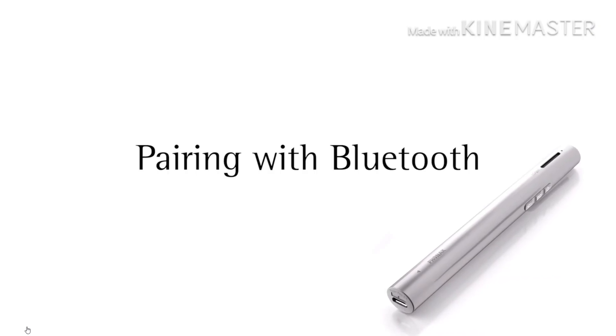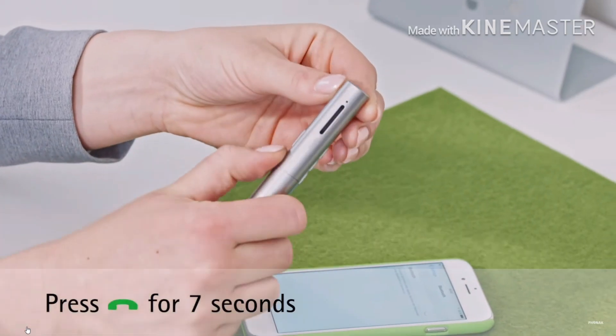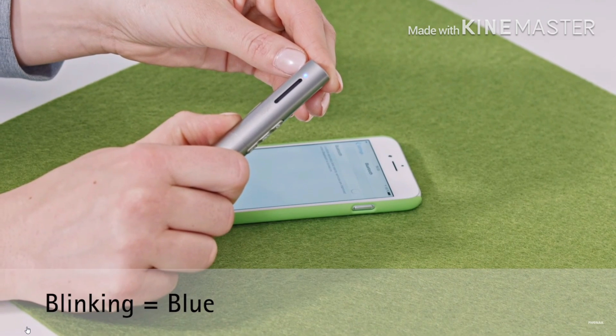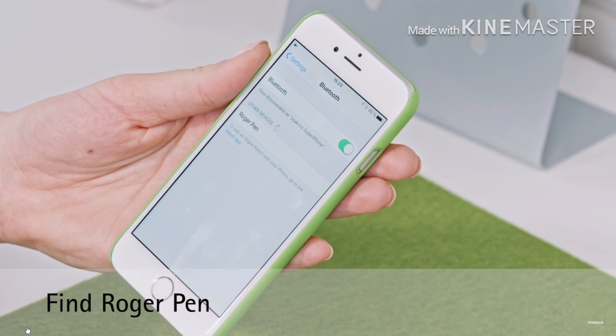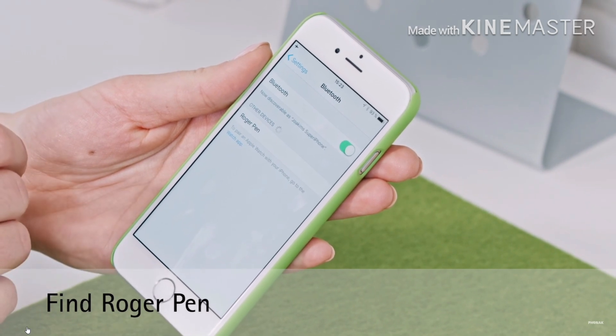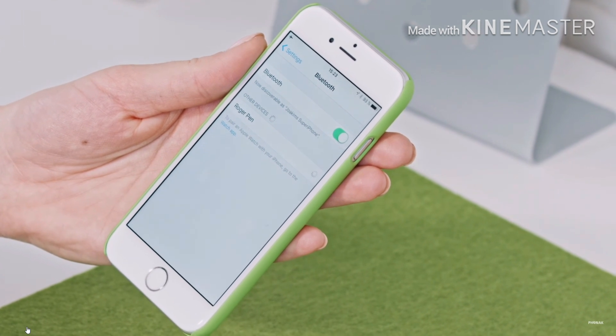To pair with your Bluetooth, press the answer button for 7 seconds and a blinking light should appear. Locate your transmitter through your phone and synchronize it.